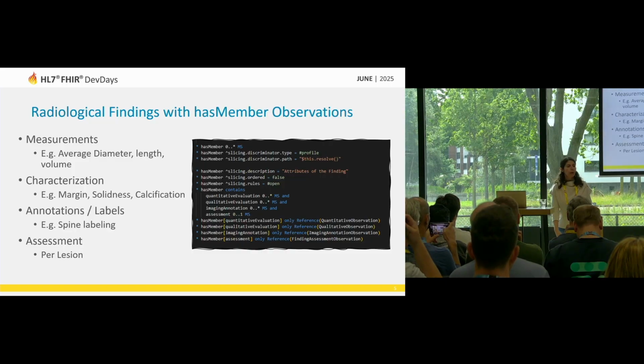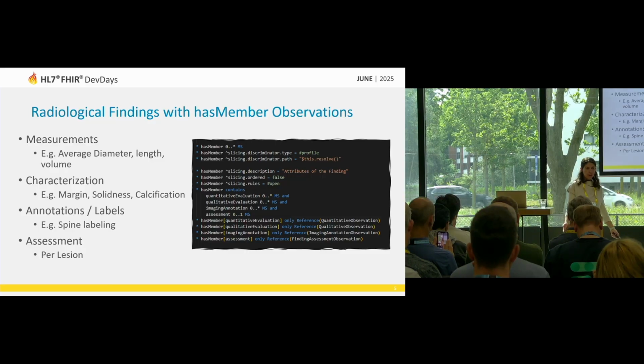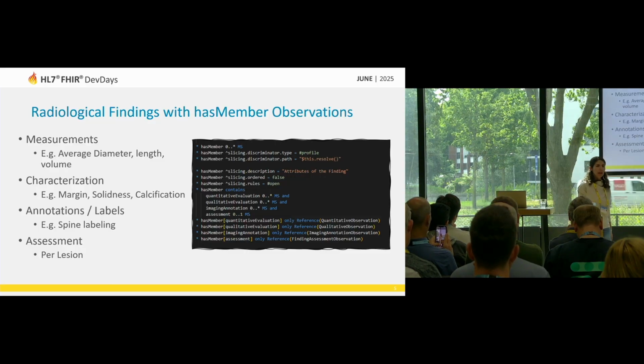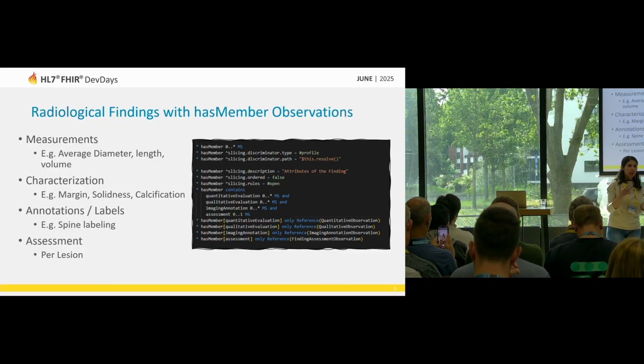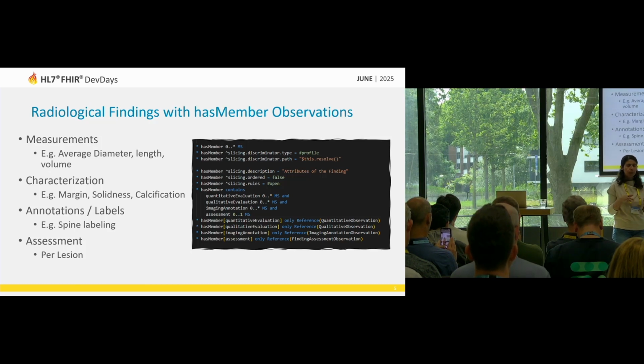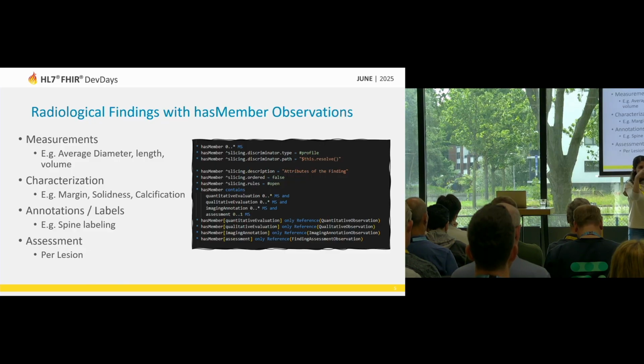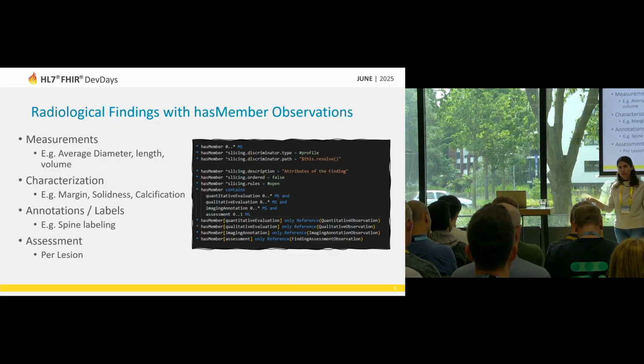However, when you are talking about clinical findings, it's not just to say, yeah, there is a tumor, but you need to say what this tumor looks like, how big the tumor is. And probably you want to also put in the DICOM images some pointers to say, yes, this is the tumor that I want to report, and probably not the small lesion that is next to it.